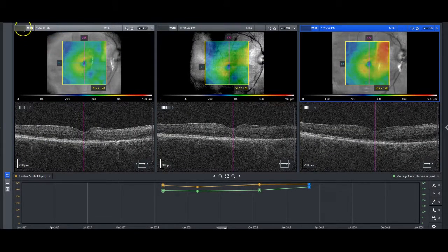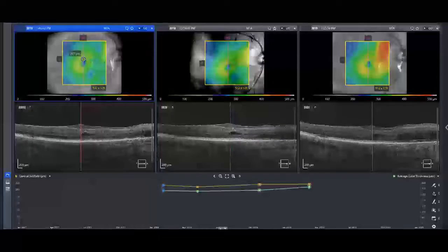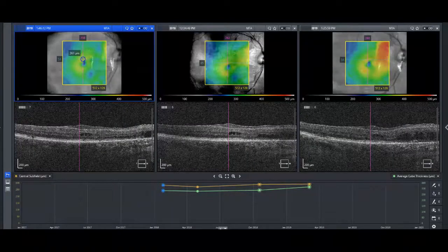If you look back in January, you can notice that the fovea is looking good. You don't see that area of cystoid degeneration, but wait a second, if you actually scroll, oh, there you go. Now you can start to pick it up. You see it right along the edge. So this is another nidus of peripapillary choroidal neovascularization, but in the fellow eye.